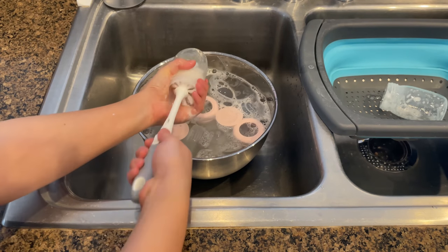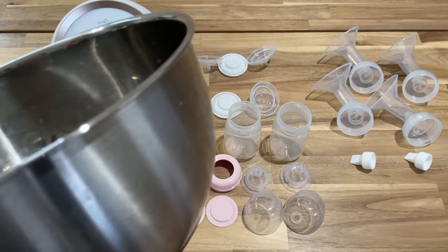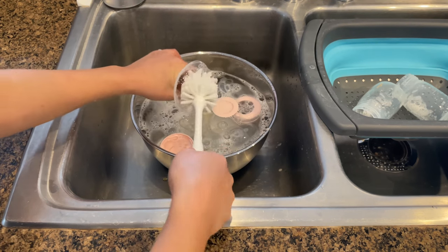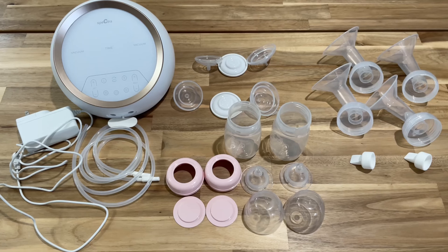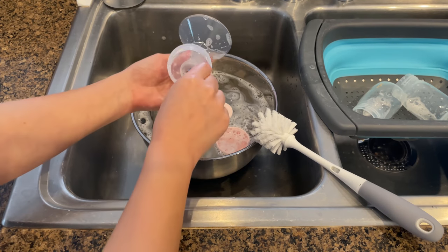It is important to use a designated basin to clean all the pump parts — not the sink, because of bacteria that can come from the sink. First wash all parts in warm soapy water and rinse well, and avoid tearing or damaging the seals. Never insert anything into the duck bill bulbs when cleaning them.